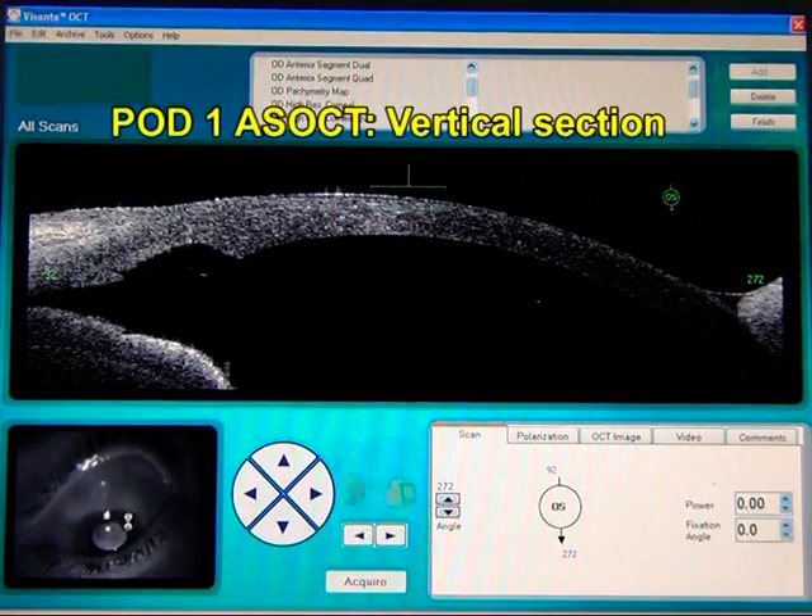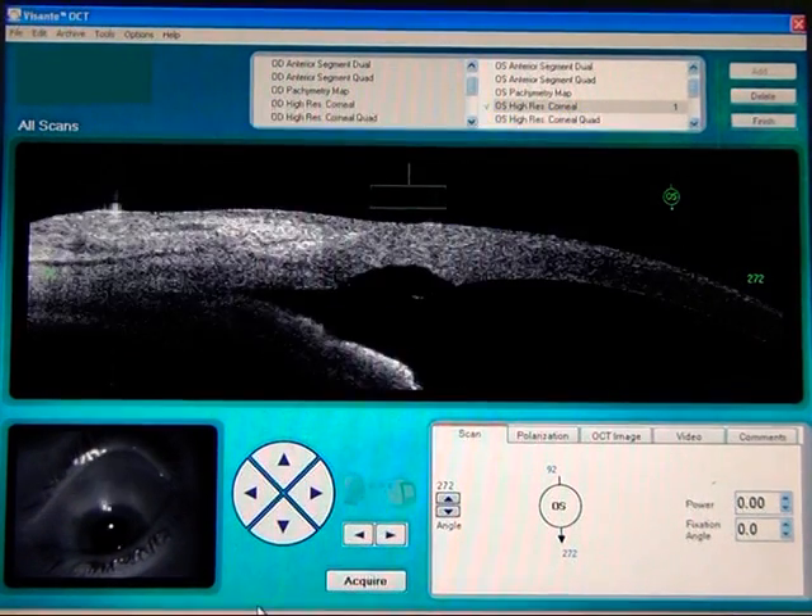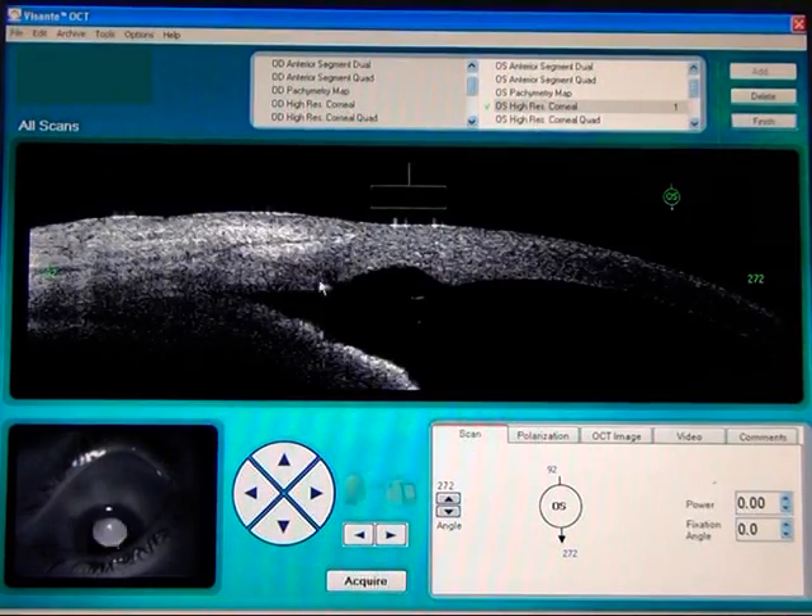Problems associated with flap tearing, laceration, etc. that are sometimes faced in trabeculectomy are done away with. Sub-conjunctival dissection or bleb elevation is via hydrostatic pressure of fluid from the IA probe when combined with phaco, or by side port irrigation if only SIGS alone is being performed, rather than by scissors dissection as in conventional trabeculectomy. Hence, there are lesser chances of scarring.